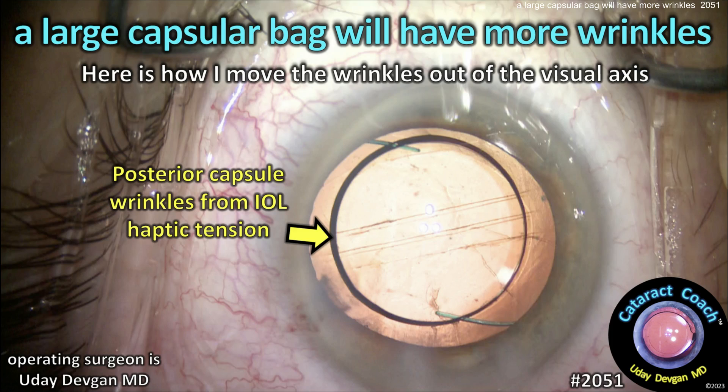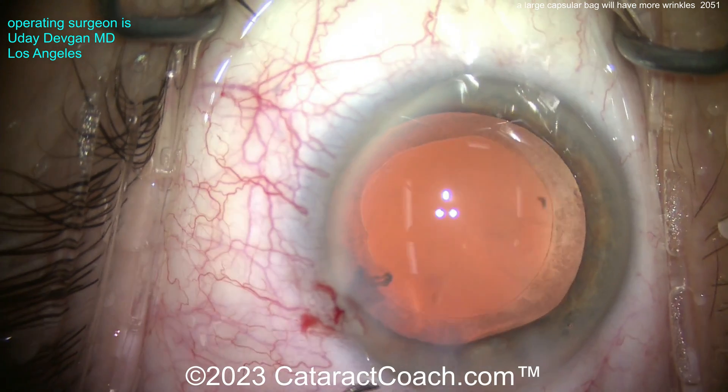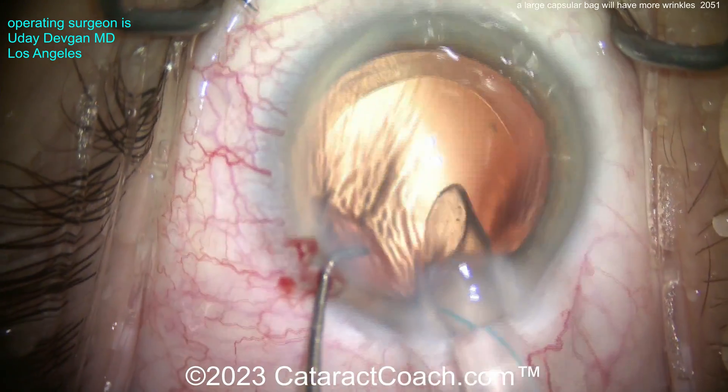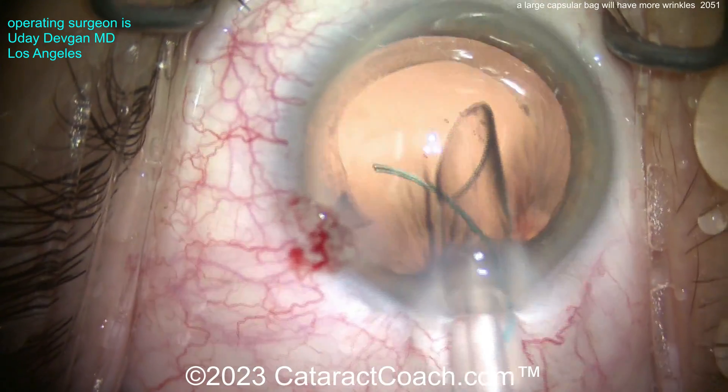A large capsular bag will have more wrinkles, and here's how I move the wrinkles out of the visual axis. This patient is a very high myope; we're putting in a minus power three-piece lens here. The capsular bag is filled with viscoelastic. Here comes the IOL — a three-piece lens.